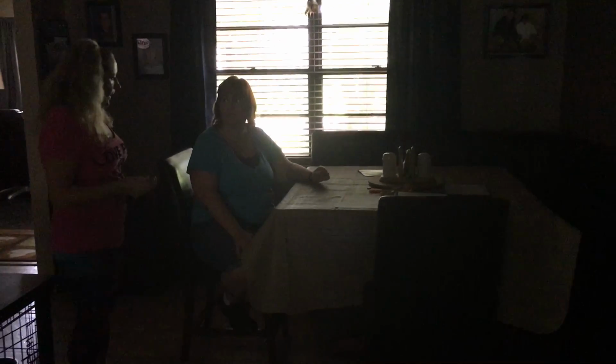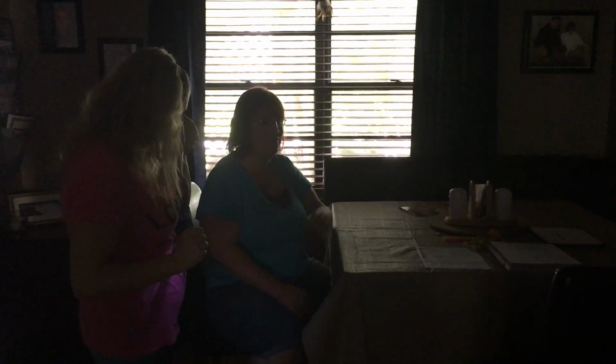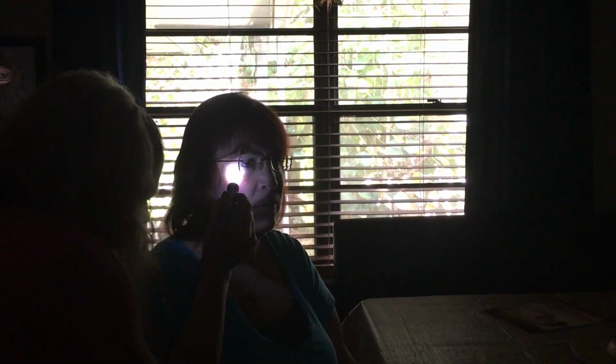Okay. So what I'm gonna ask you to do is, there are some blinking lights there. I think it's the router. If you can focus on those lights, and first I'm gonna shine this little light into your right eye, and then into the left eye. Okay? So just try to focus on that light right there. Okay, so that one was the right one. Let's go and try to do it on the left side. Good.